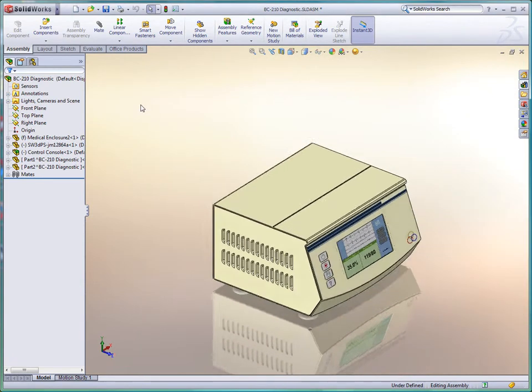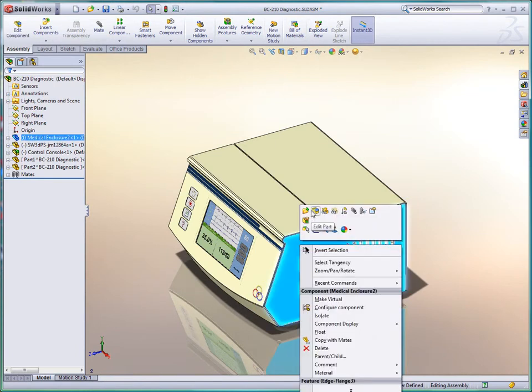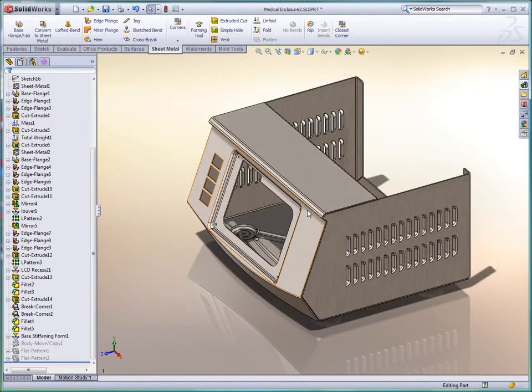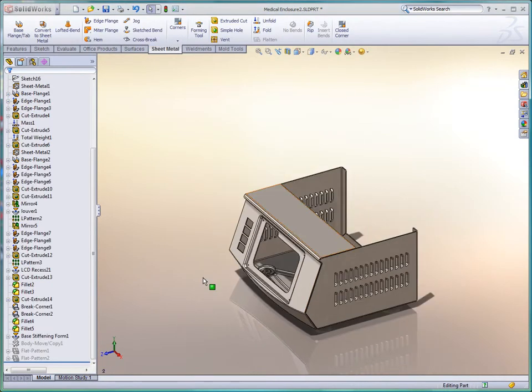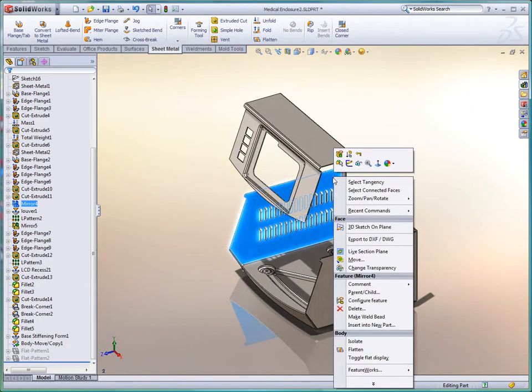A plain looking box is no longer acceptable. Enclosures must be aesthetically pleasing. SOLIDWORKS provides a wide variety of tools to choose from, including plastic design tool sets, or in this case, advanced sheet metal capabilities.